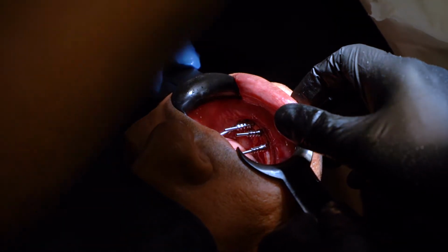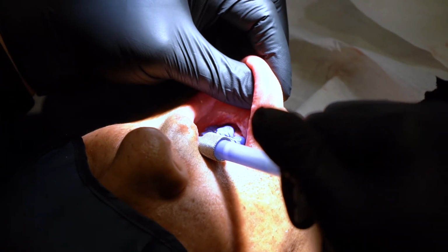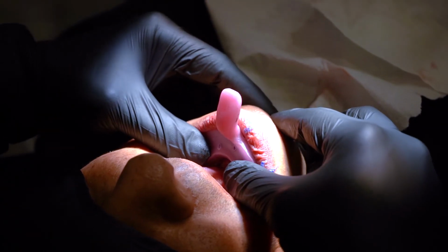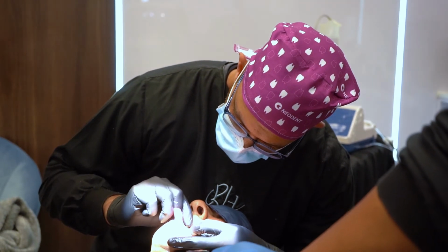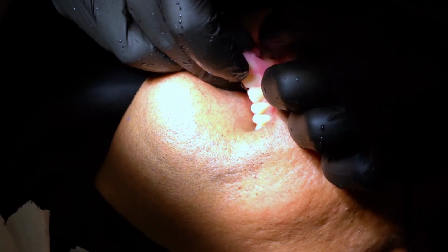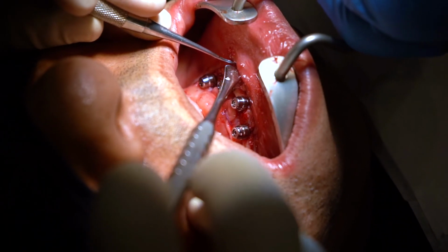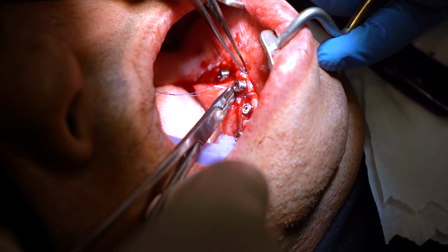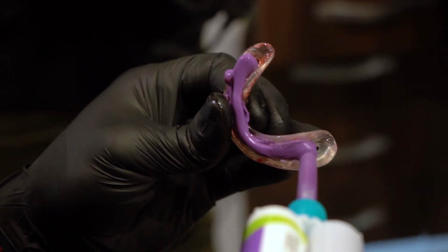Impression material needs to be nice and rigid as well. You don't want something that's going to be too elastic. Pretty much the impressions are taken. The bite registration has been taken as well. So the patient gets to recover. All of this work, the impressions go to the laboratory, and the guys from Inline will start manufacturing the prosthesis on the implant analogs. It's Thursday afternoon now at 5 o'clock, so we'll probably have things ready for him by tomorrow afternoon, and then we can deliver some teeth for him.